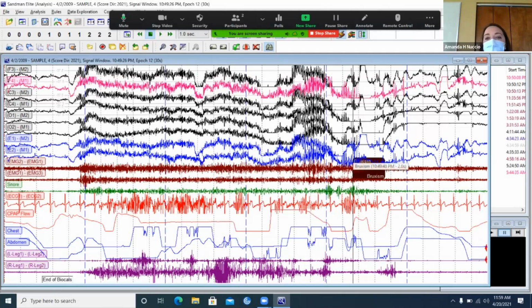It will happen where you'll have a patient be tense in the beginning of the night, and even when you guys are in there, you're tense and you can see that on the EEG. It doesn't come through on the impedances. Your impedances will still be good. It's picking up the tension of your muscles. You realize you have muscles on your scalp. And that's what I'm saying, impedances don't tell the whole story, because your impedances will be fine, but your signals will look really thick.